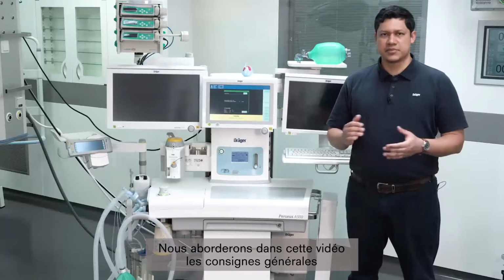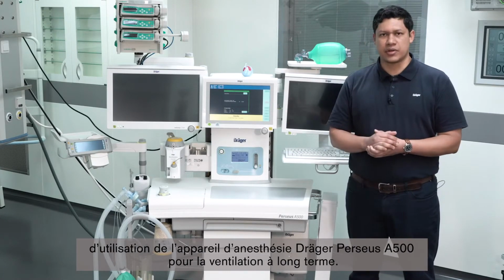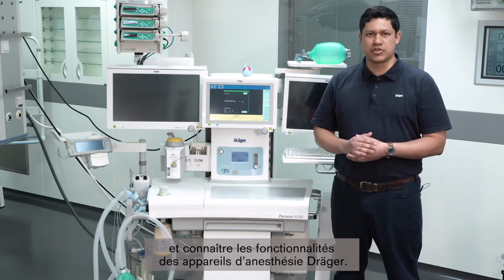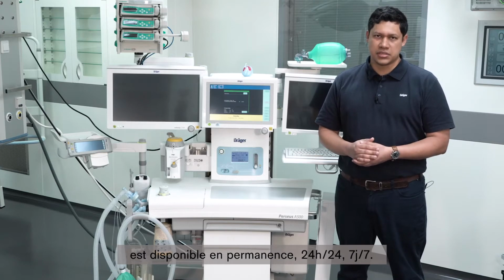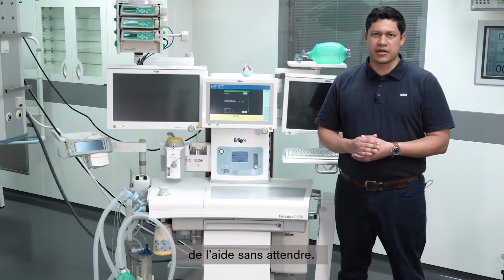The objective of this video is to provide you with the general recommendations on how to use the Dräger Perseus A500 anesthesia device for long-term ventilation. Medical staff should be instructed in the use of the medical equipment and should be familiarized with the functionalities of the Dräger anesthesia devices. Make sure an experienced anesthesia colleague is always available, like for example an anesthesiologist, 24/7. The recommendation is, in the case of any problem, call for help in an early stage.